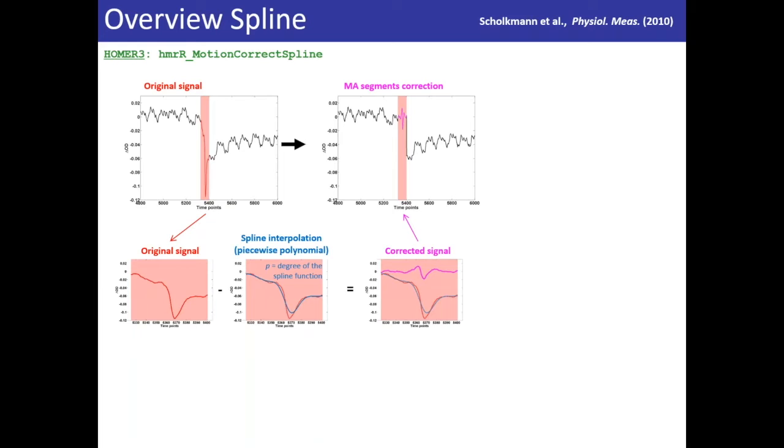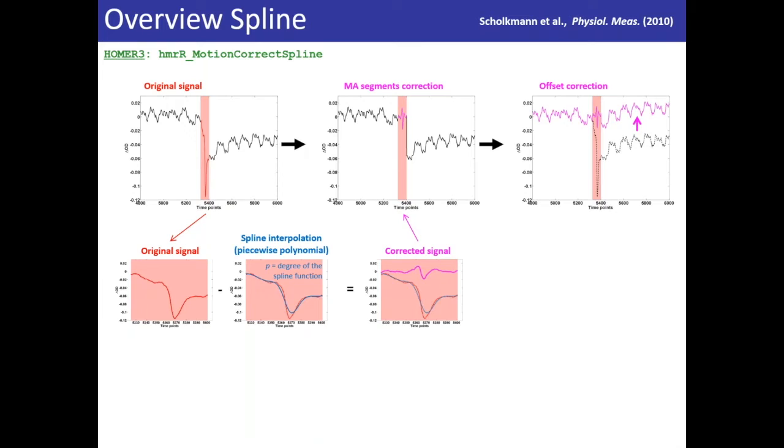Now you can put the signal back into the data, but you see we have an offset here, or a baseline shift, when we put it back into the original signal. So the next and final step is to do an offset correction. Here we corrected for this offset, and now the signal level is the same before and after the motion correction. So this method is really good at correcting baseline shifts, those types of motion artifacts.